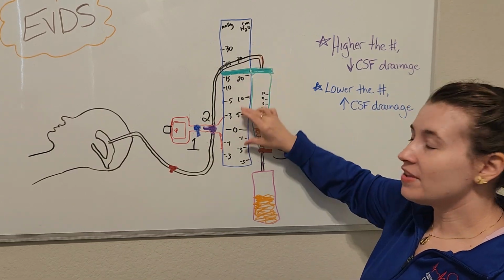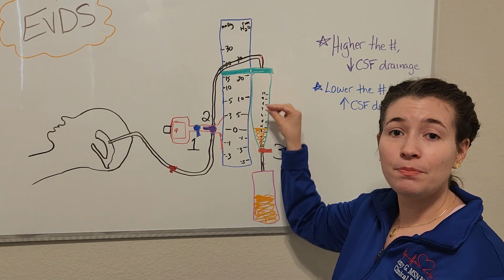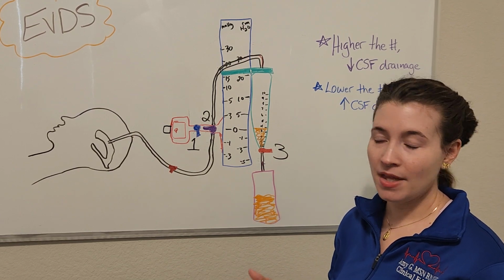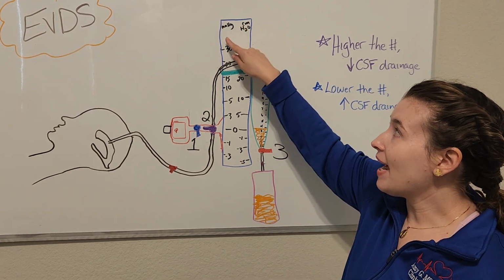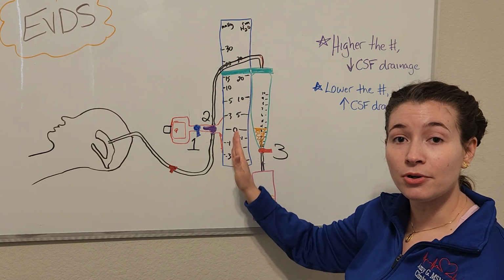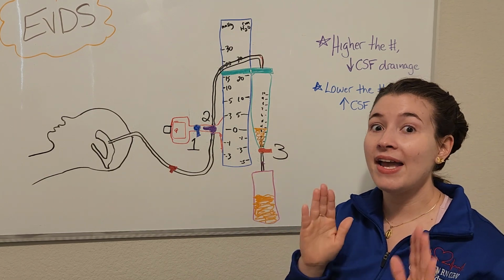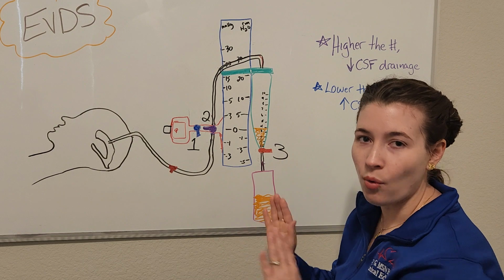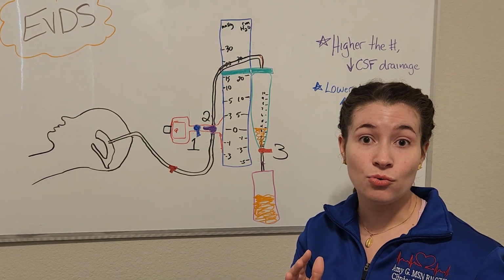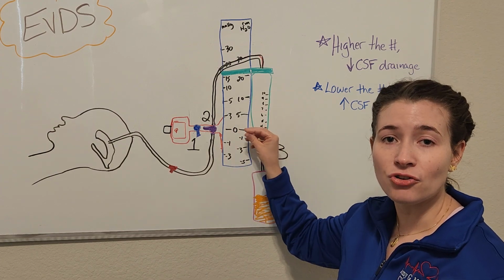Now, this portion of the EVD right here, this is the scale that we're going to be setting the buretrol to depending on the orders that the provider enters in. On this scale, I have 2 sides. One side is set to millimeters of mercury, and the other side is set to centimeters of water. And they are different. The numbers don't quite add up. So it's important to be able to look at the provider's orders so that you know which side you're going to be using to set your drain to.